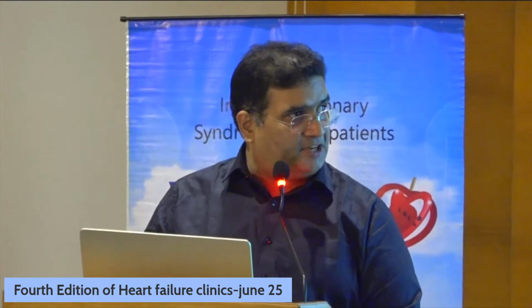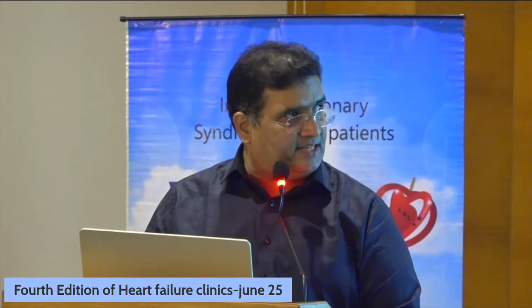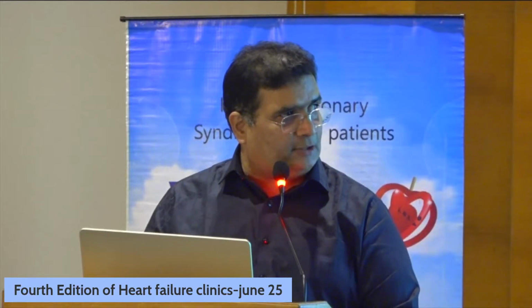Similarly, you can see in this patient a hugely dilated ventricle with mitral regurgitation. In ischemic heart disease, about 1/3 of the patients tend to have a functional mitral regurgitation. We can also see a left ventricle thrombus. You can see here at the apex a left ventricle thrombus in a patient. This is a layered thrombus, of the same intensity as that of the endocardial border, which indicates it's a chronically present thrombus.